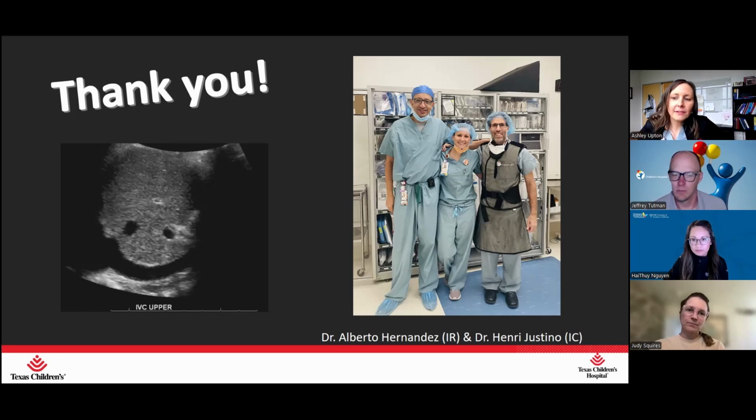So at the end of our exams, we are responsible for checking our IQR numbers. And if it's too high, then we will just redo the exam. And if we can't get it, we can't get it, because some patients are really difficult and you might not be able to get it. But we do our best to pay attention to that number and redo the samples, to get it under that 15% for meters per second, or in kilopascals less than 30%.